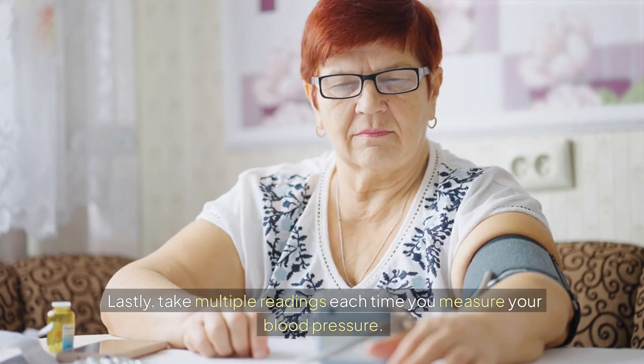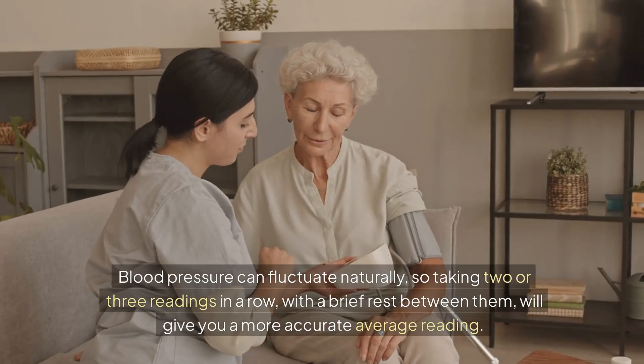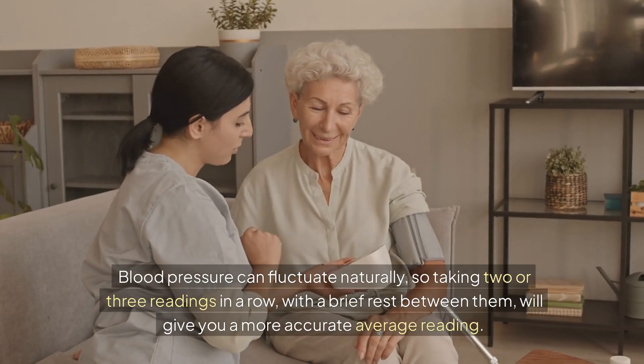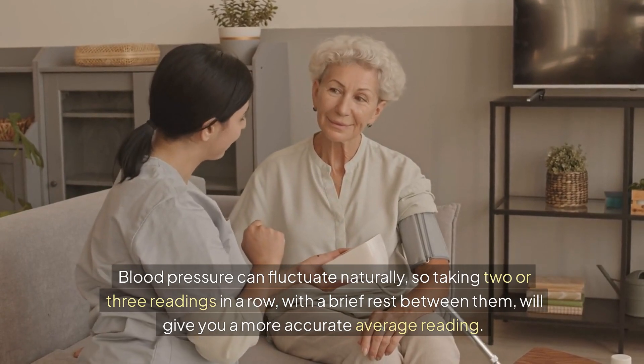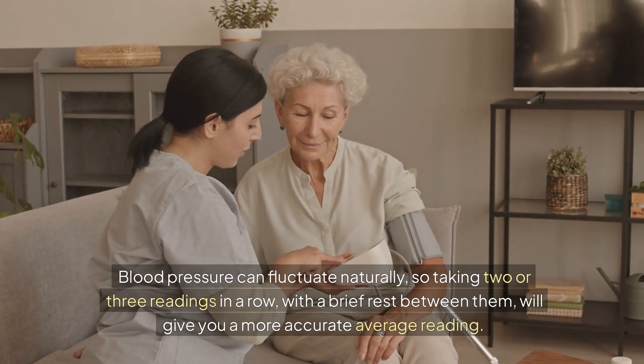Lastly, take multiple readings each time you measure your blood pressure. Blood pressure can fluctuate naturally, so taking two or three readings in a row with a brief rest between them will give you a more accurate average reading.